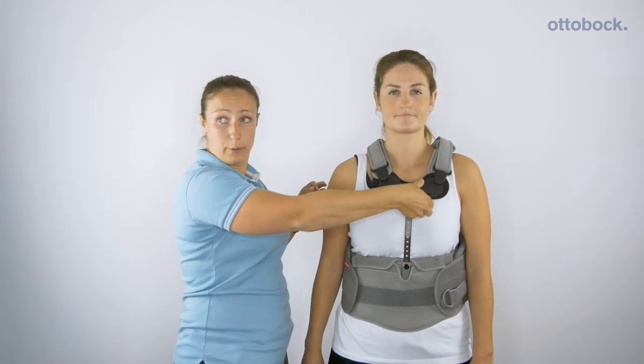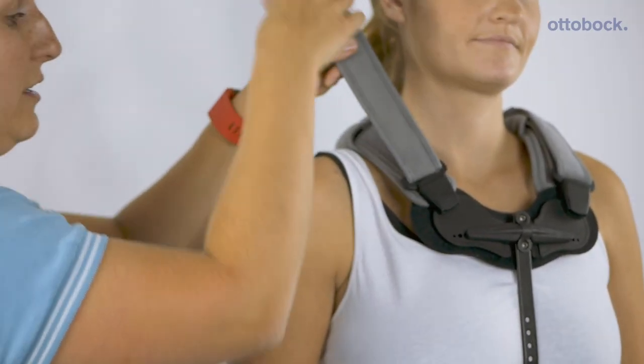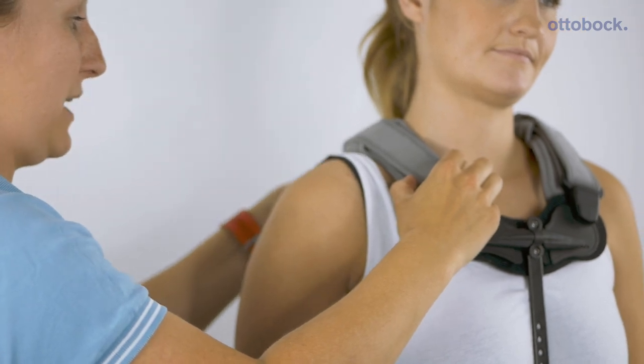The shoulder straps click into the sternal section. This is on a pivoting point so that it optimizes the fit, and in fastening the shoulder straps you can improve that fit to the patient.